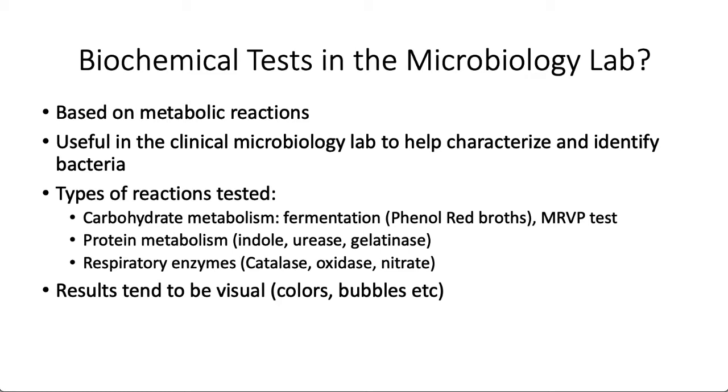But in microbiology labs, you will have multi-test systems where you can test 15, 20 of these tests at the same time, and there are patterns that will give you codes and that will help your identification basically in less than 1 day.